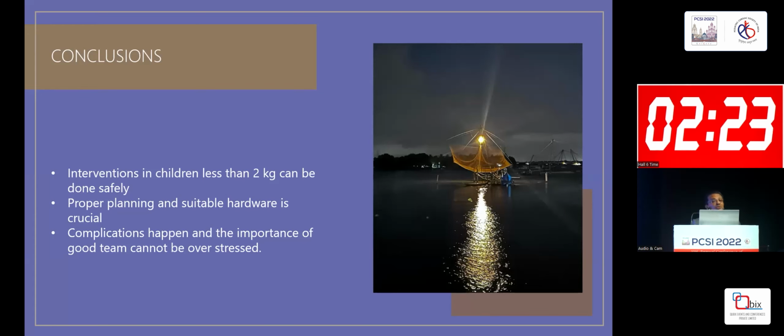So if the LPA stenosis is significant and if I feel my surgeon can handle it, I usually send it to the surgeon. But I have also stented both RPA and LPA simultaneously with 2 stents in bifurcation stenosis. So if the duct is sufficiently large, I have placed 3 millimeter stents into both branch pulmonary arteries to provide significant palliation in at least 1 or 2 kids. And these children have undergone Glenn and corrective surgery later. So it's possible.